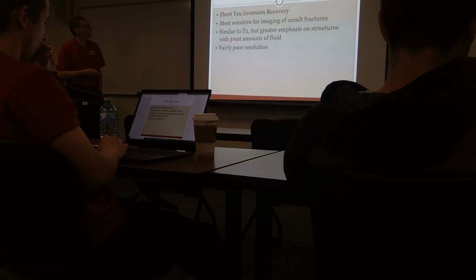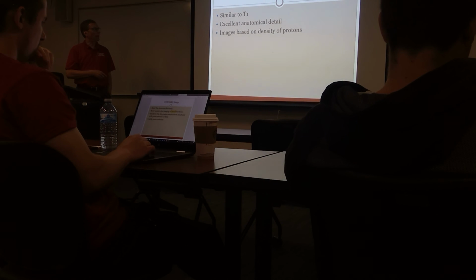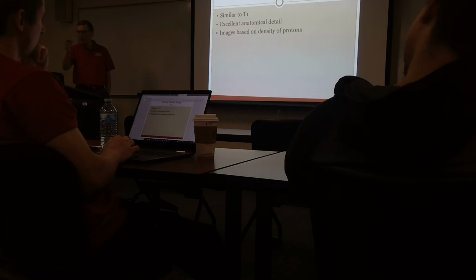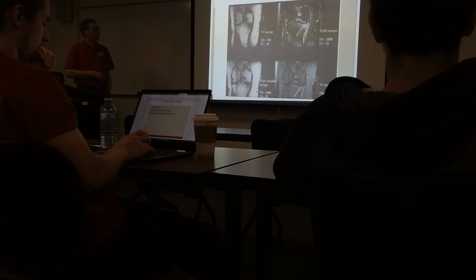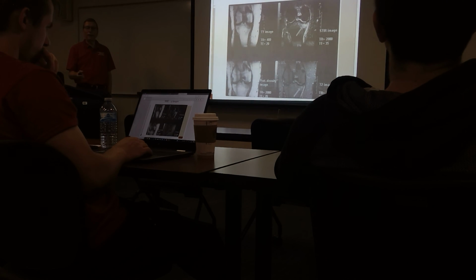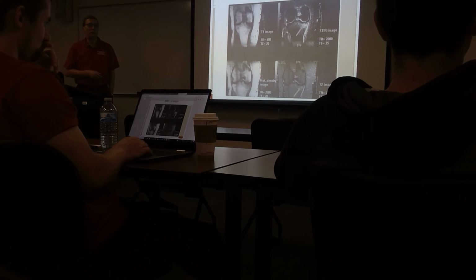Okay. STIR is similar to T2, but with greater emphasis on structures and greater amounts of fluid, and fairly poor resolution. Proton density is based even more so on the density of protons in addition to the release of the energy with decay, similar to what T1 did. Okay. You're going to hear about fat suppressed MRs, non-fat suppressed MRs, all different kinds. As they occur within the course, we'll mention them, but I don't want to burden you with lots of information now because it just gets too crazy.